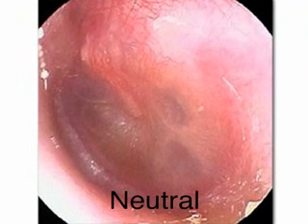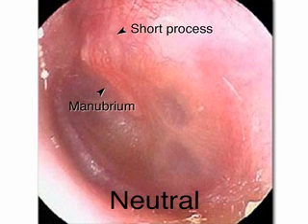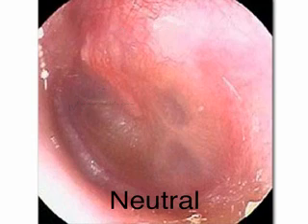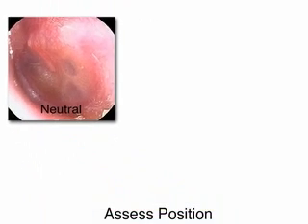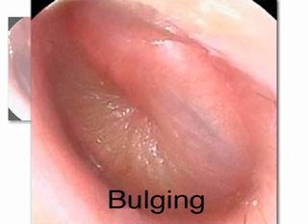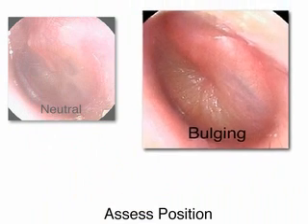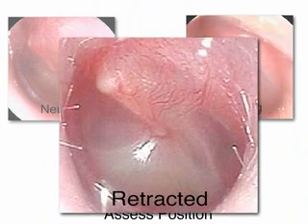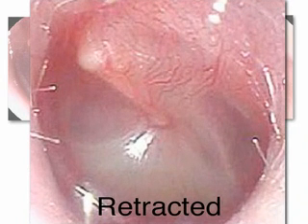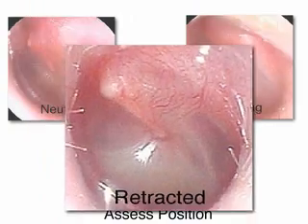Assess the position of the tympanic membrane by visualizing the manubrium and short process of the malleus. When the tympanic membrane is in the neutral position, the manubrium and short process are clearly visible. When the tympanic membrane is bulging, the short process is not visible and the tympanic membrane appears convex. When the tympanic membrane is retracted, the manubrium appears foreshortened and the short process appears prominent.